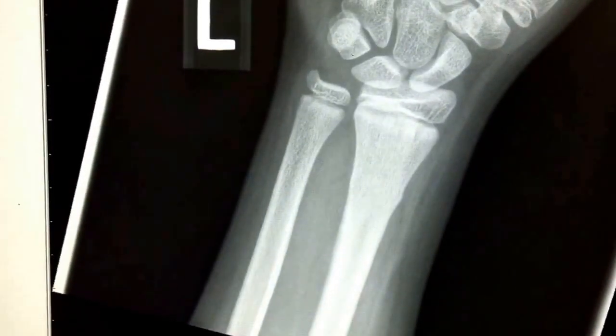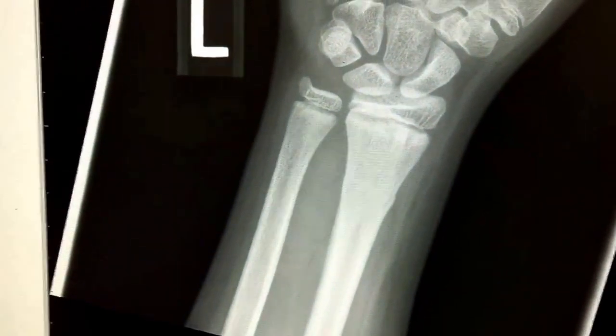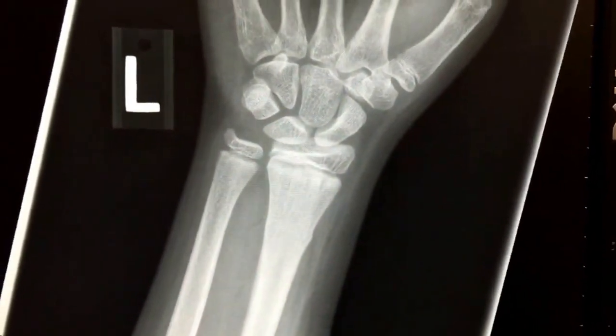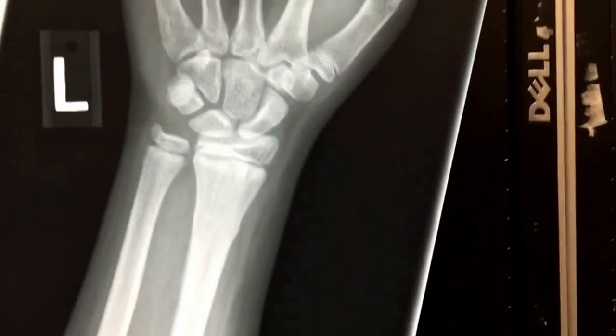It's treated with a splint, casting, and follow-up. The other option: if you wouldn't have seen that buckle fracture and the patient was painful on palpation, you would treat them as a fracture either way, because you can never rule out any kind of fracture across a growth plate.